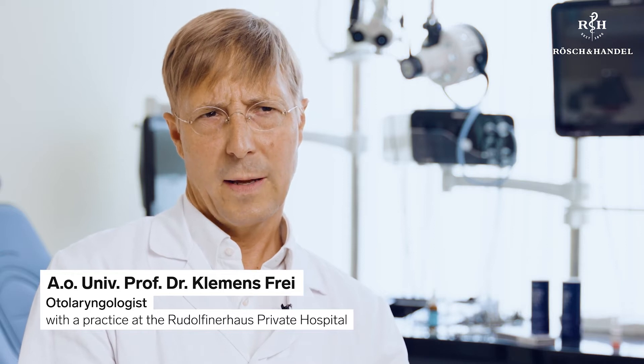In the ear, nose and throat region, I only use the elastic sticks because they are smaller, gentler in use and intended for application at discrete points. The rigid sticks are more suitable for treating larger areas, in wound management for example. The benefit of treatment with silver nitrate sticks is that they target the surface of the mucus membranes without their action going too deep — i.e., without reaching the underlying cartilage. This means damage to the cartilage beneath is extremely unlikely.